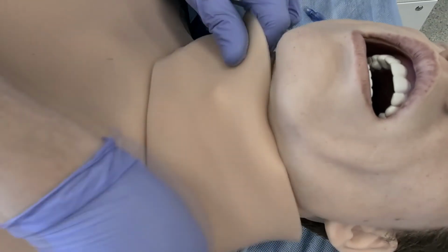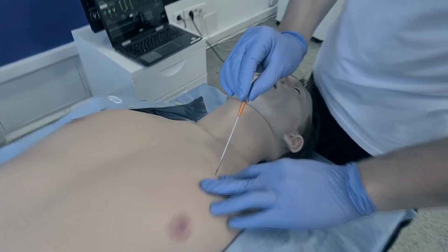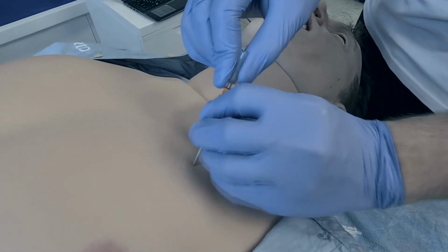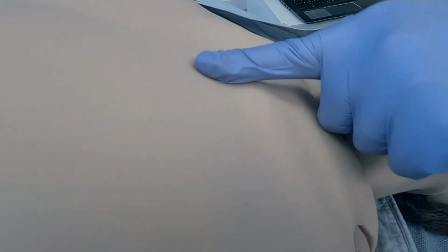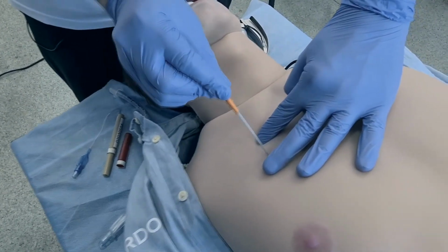After making a puncture or an incision, you can simply rotate the neck piece or flip it for more usage. One of Leonardo's coolest features is tension pneumothorax decompression. It can be performed on both sides up to 500 times with no consumables and no visible damage. Realistic anatomy and palpable ribs make it easy to find the right spot for puncture.